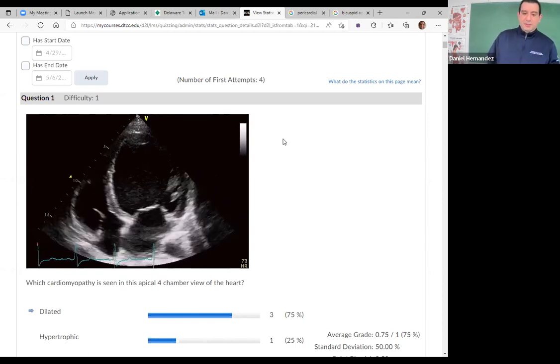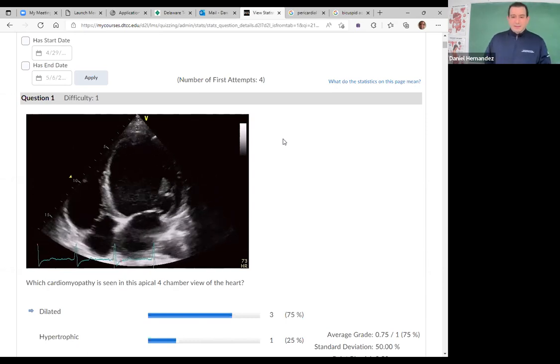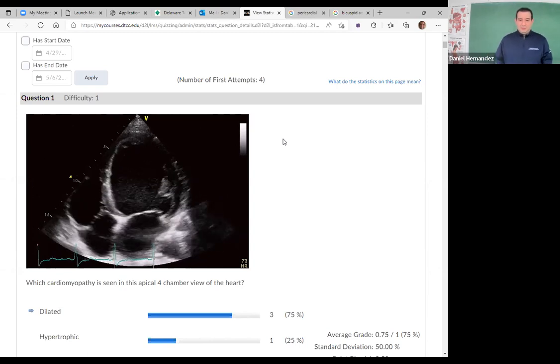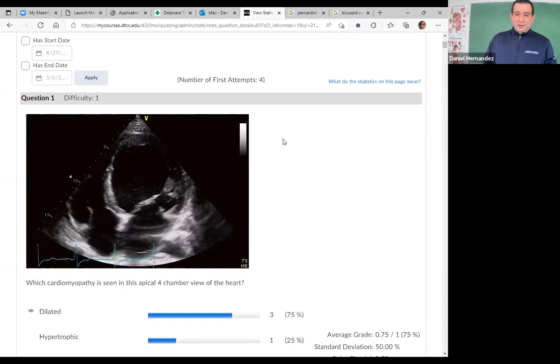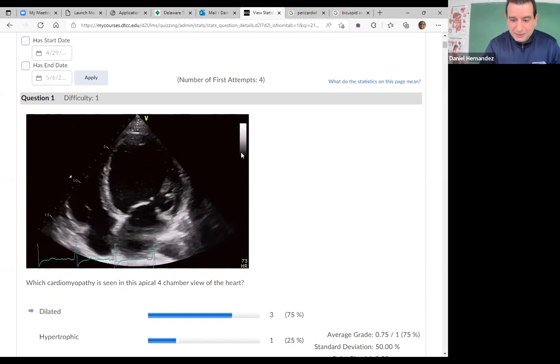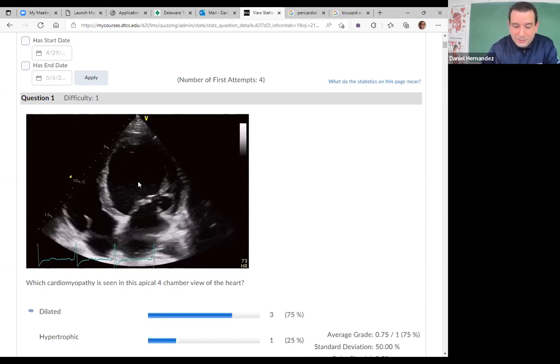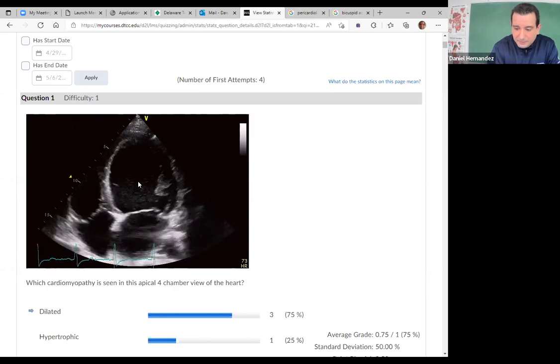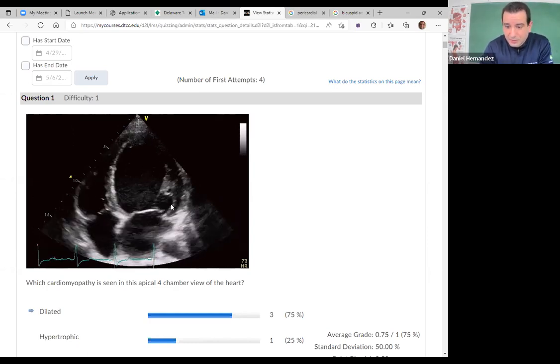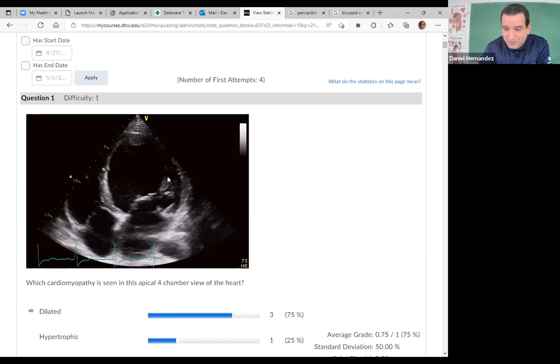The other thing to realize that tells you this is dilated cardiomyopathy is the reduced EF. You can obviously see there's a tremendous amount of blood in that chamber that is not being ejected during systole. So that remains. This patient obviously has a very low ejection fraction based off of this. So don't get confused. You can kind of see the myocardial layer. This is all papillary muscle and cord.